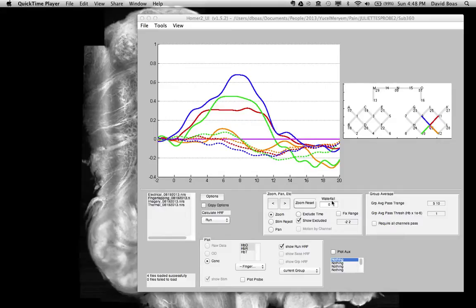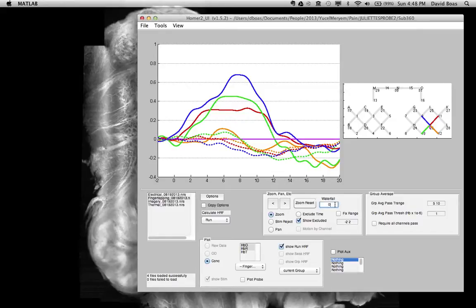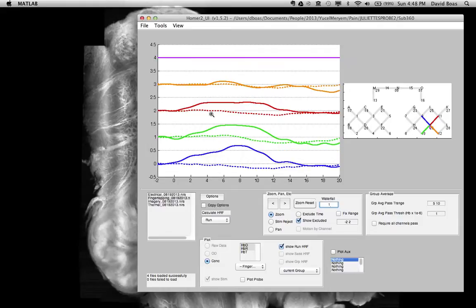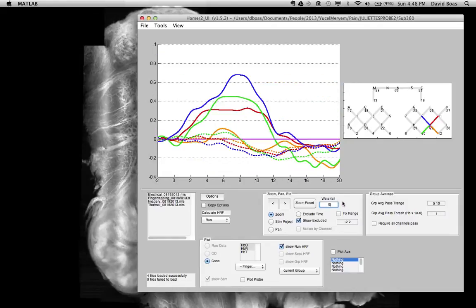We have this waterfall plot where if you put a number here, it's going to separate different channels of data by the amount indicated. On this scale, you can see the maximum response is about 0.8. So I'm going to put a separation of one unit on this scale, and you see it nicely makes a waterfall plot so you can easily distinguish all of the channels. If you go back to zero, it collapses everything.